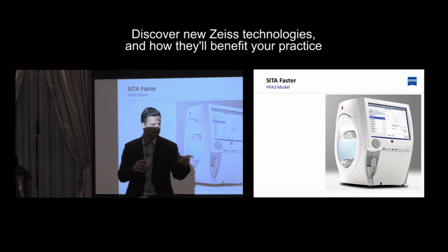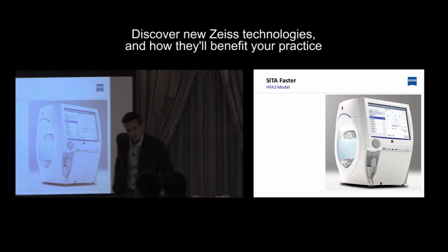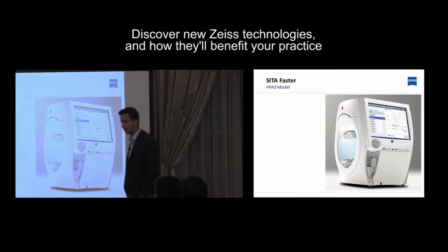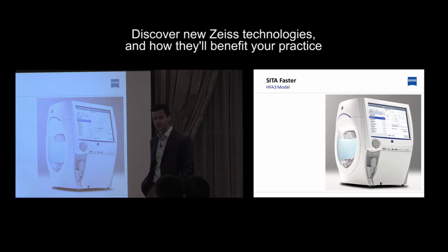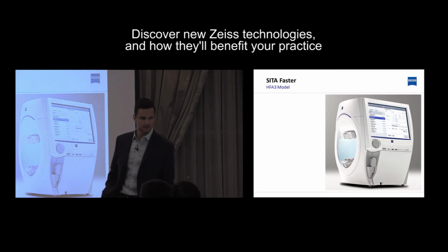Other questions? This is patient management. If the patient has a history of floaters, could you legally take this photo without BIO? I'm not a lawyer and I don't play one on TV, but I would probably say do BIO.